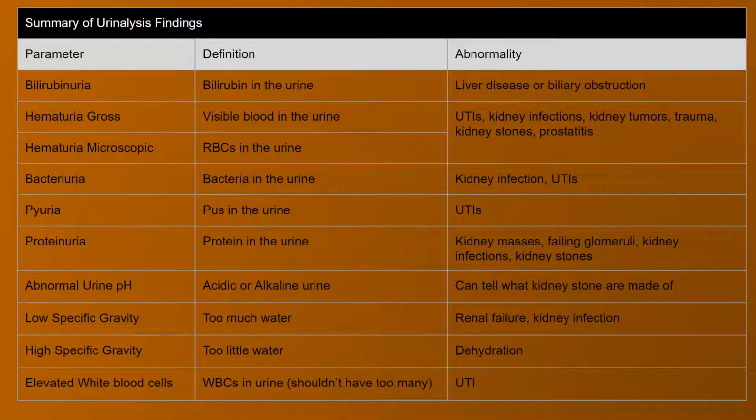This chart is going to show us the abnormalities that we can discover through urine analysis. After a patient gives a urine sample, it is sent to the lab, and a dipstick is typically dipped into the urine. The way that dipstick comes back, the coating of the colors and everything on it, is going to tell the lab tech a lot of information. And what it shows them, let me see if I can draw a picture here.